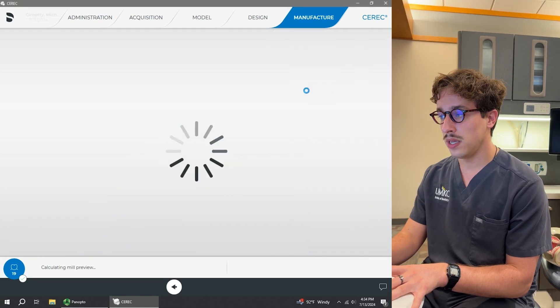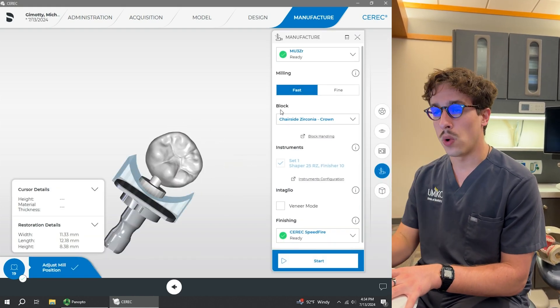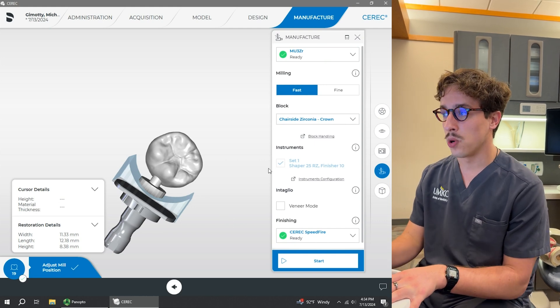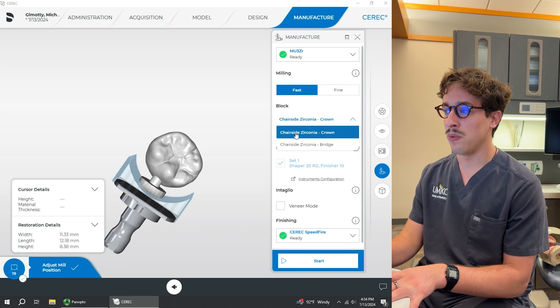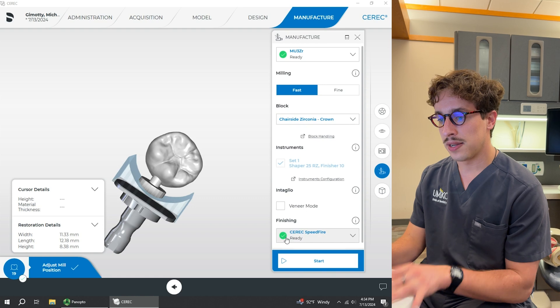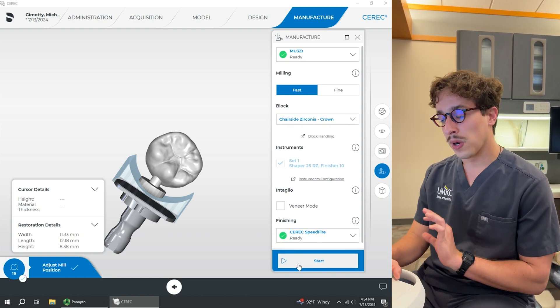We're going to choose fast for milling because there's actually no difference in quality between fast and fine milling — it's just going to waste more of your time if we mill it fine. We're going to choose the block, and we need to make sure we have it selected as chairside zirconia. Then it's going to send it to the Speedfire, which you'll be able to see in a minute. So we're going to hit start.